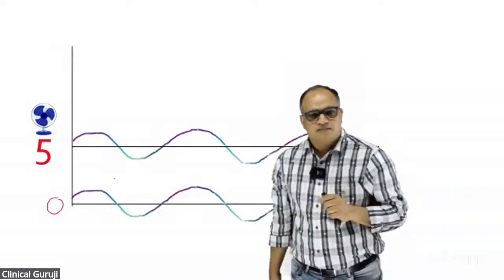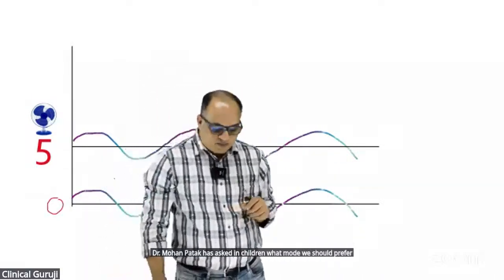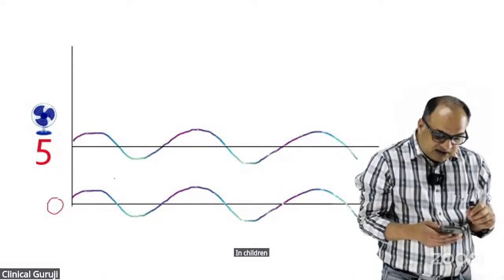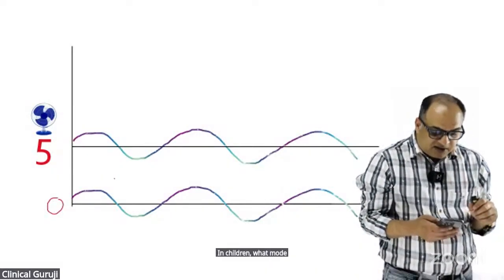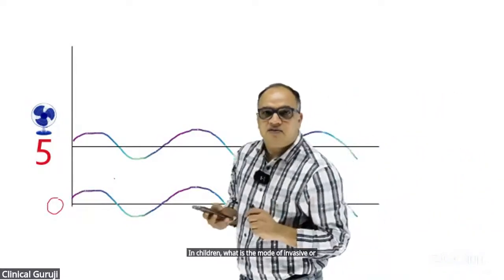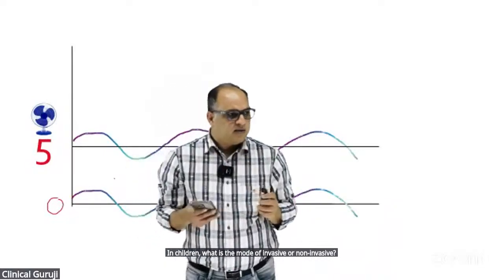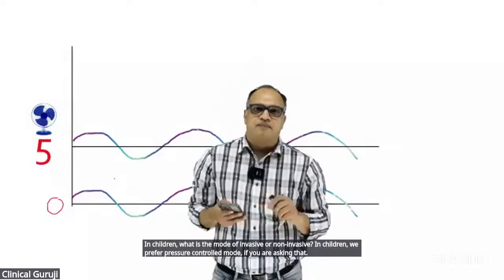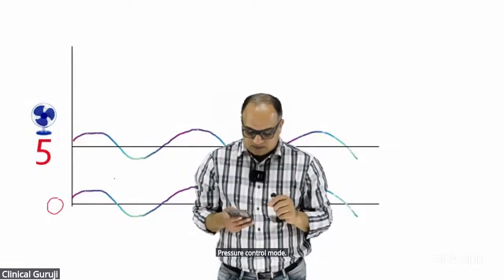Dr. Mohan Pathak has asked, in children, what mode we should prefer? In children, what is the mode of invasive or non-invasive? In children, we prefer pressure controlled mode, if you are asking that. Pressure controlled mode.